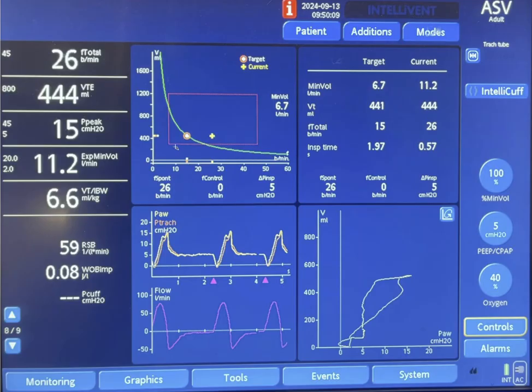On that green curve you will see that there's a target and the target here tidal volume 440 and respiratory rate 15. And then you get a box that will give you the limits.